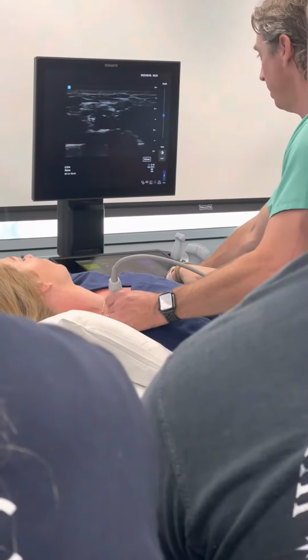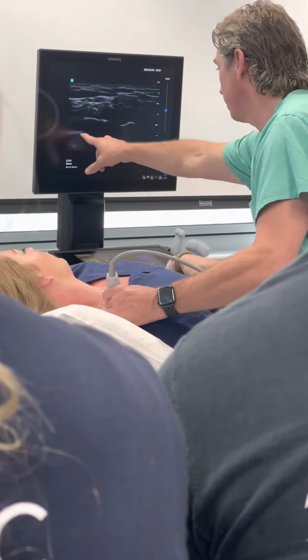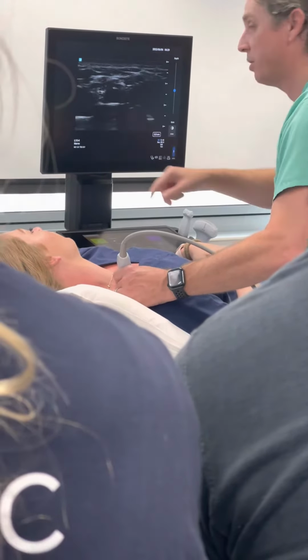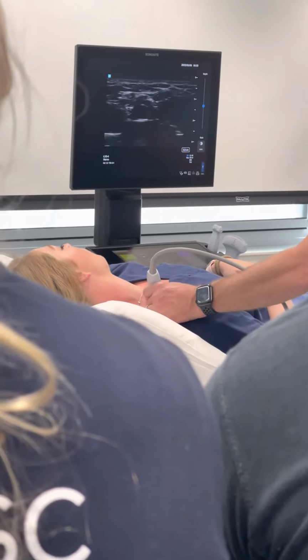I'm gonna take a breath in and out for us. All right, look at that. You can actually see the visceral parietal pleura kind of slide past each other. You kind of get that little shimmer effect right there. So then now we're actually looking at the structures we're trying to visualize.